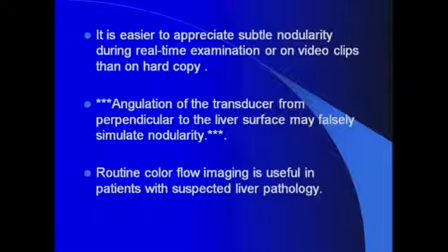It's very important when you evaluate the liver surface to make sure that you do this with video clips or real-time examination. Otherwise, if you get some angulation of the transducer from the perpendicular to the liver surface, you may falsely simulate nodularity. Unfortunately, the false positive findings will increase as you interpret your images based on still images. So real time is very important to evaluate the liver surface and avoid this pitfall.